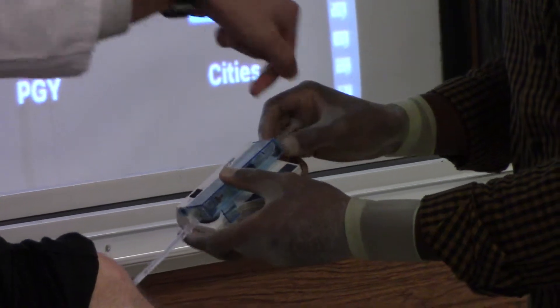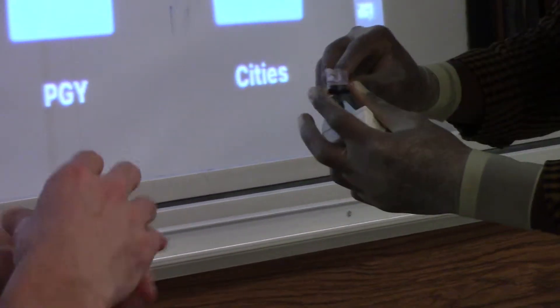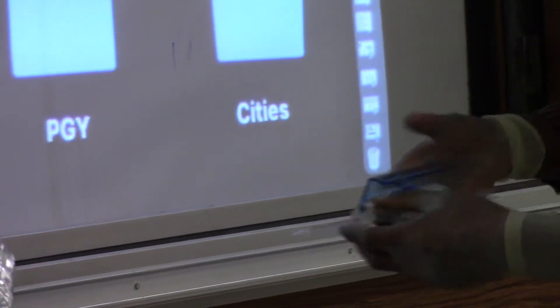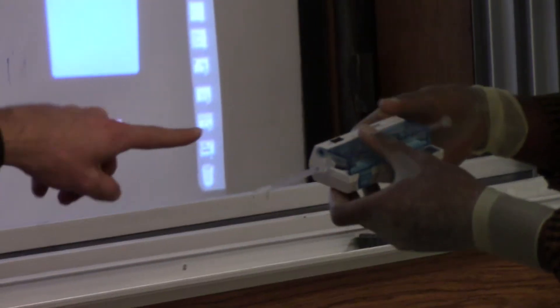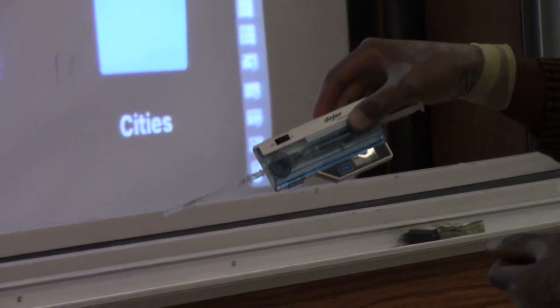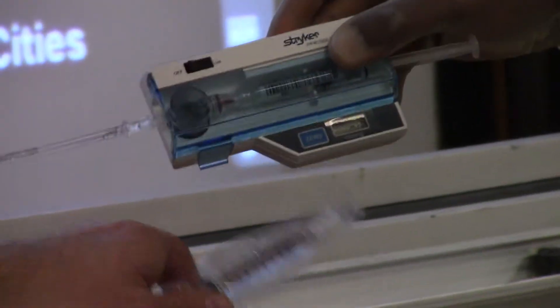If you rotate the back part so it's kind of flat across, then it's locked down. The back part of the syringe — you just have to kind of turn it so it lies flat. It locks in. Now, do the batteries work? Hopefully. Now we have some sort of value down there.